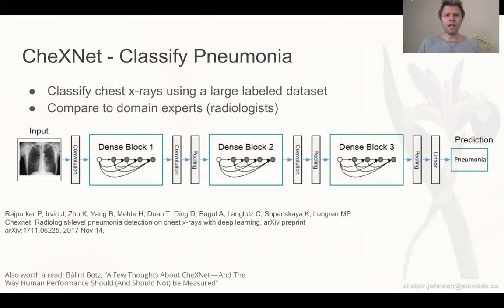And the short version of it is that the radiologists were evaluated in an environment that wasn't true to their daily practice. So they are using smaller, compressed images, with only 1,000 by 1,000 resolution, right?